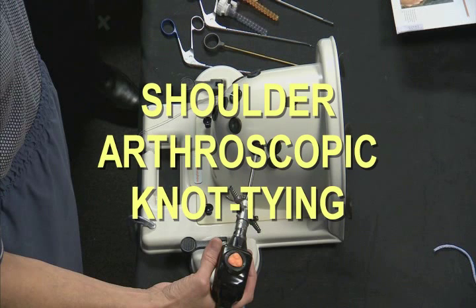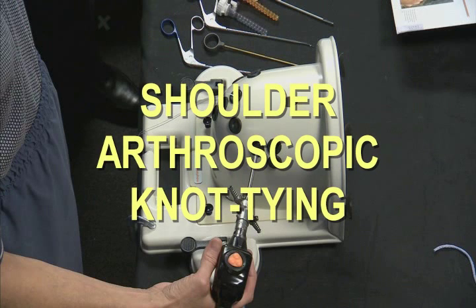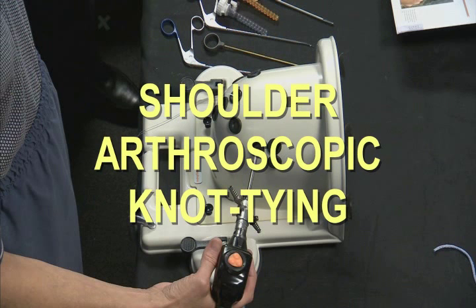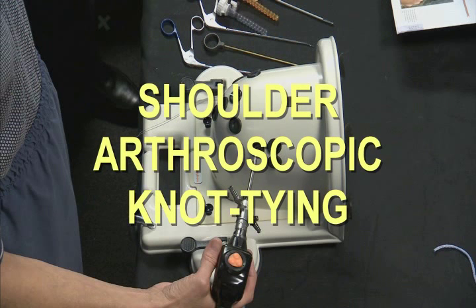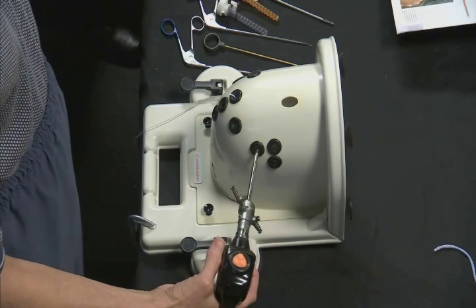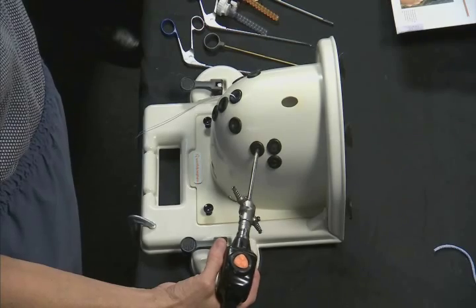To become proficient in arthroscopic surgery, one must practice, practice, practice. Having access to a shoulder model and knot tying posts is very important. This is a SAM model. Practice a lot before you get into live surgical action.